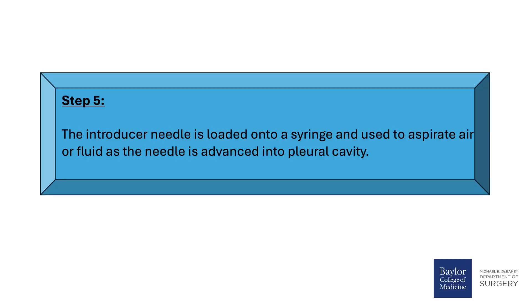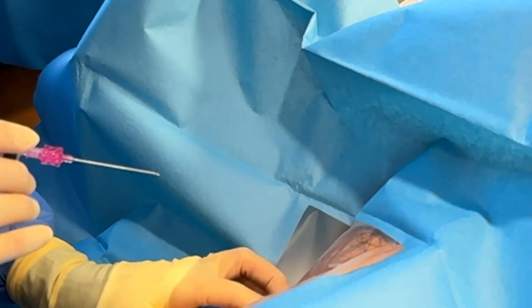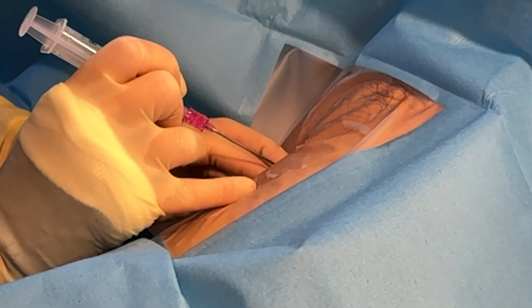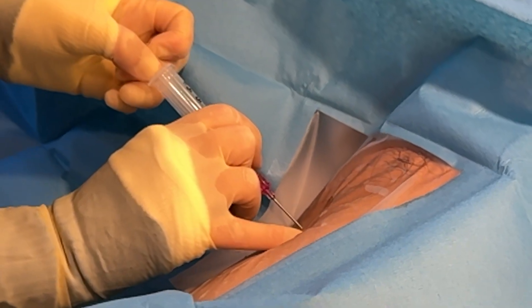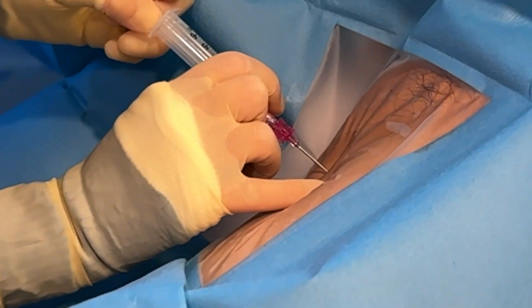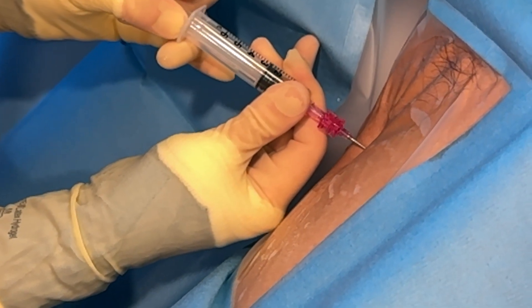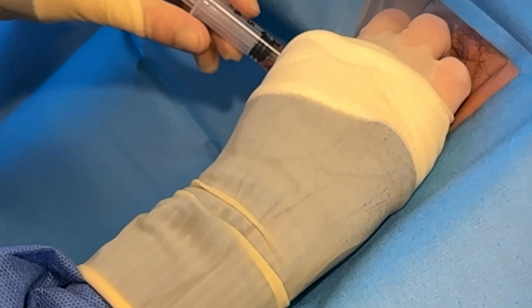Step 5 continued: The introducer needle is loaded onto a syringe and used to aspirate air or fluid as the needle is advanced into the pleural cavity. The provider communicates: 'I'm using my fingers to feel for the ribs. You'll feel pressure, but you shouldn't feel sharp pain. Let me know if it's very painful.' Confirmation: 'I'm in the fluid — I know I'm in the right spot.'